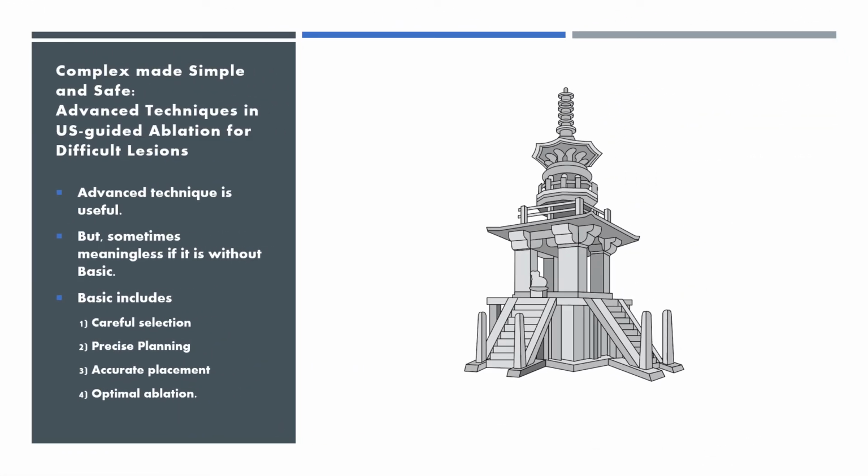Finally, I'd like to emphasize that the basics are more important to provide successful ablation. Of course, advanced technique is useful, but without the basics, it is sometimes meaningless. Basics include careful selection, precise planning, accurate placement, and optimal ablation. So please always keep in mind basics beyond the novel. Thank you for your attention.